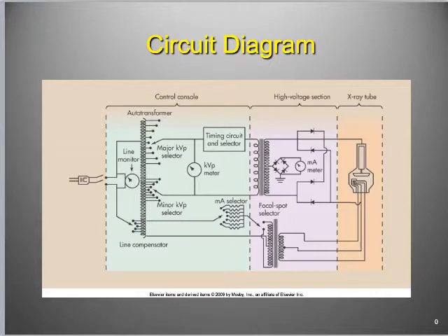Yeah. If you were to see inside the X-ray tube at that moment that you're holding down just the rotor, the anode is starting to spin very, very fast. Imagine it's spinning like 3,000 rotations per minute. And on the other side, on the filament side, it's starting to glow bright red, and it's getting really, really hot, right? That's all that's happening, though. It's spinning really fast on this side, and it is burning like the sun over here.